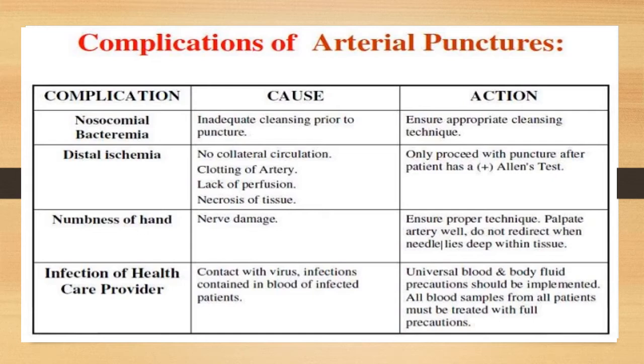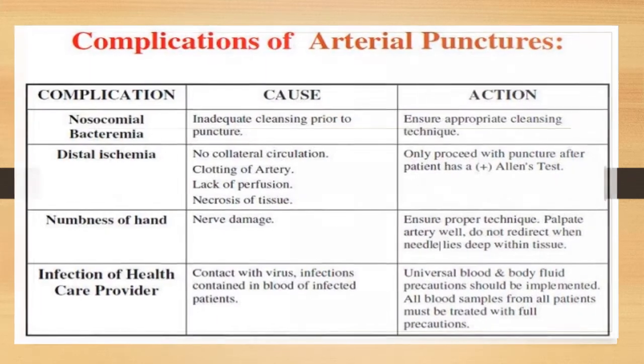And infection of the healthcare provider, the cause is contact with the virus infections contained in the blood of infected patients. The action is universal: blood and body fluid precautions should be implemented. All blood samples from all patients must be treated with full precautions.